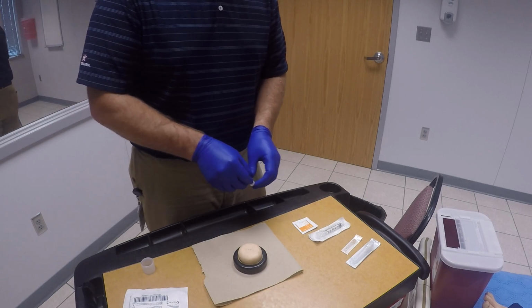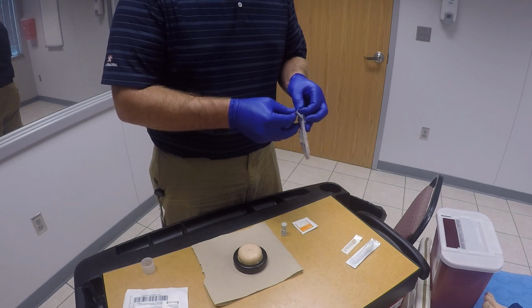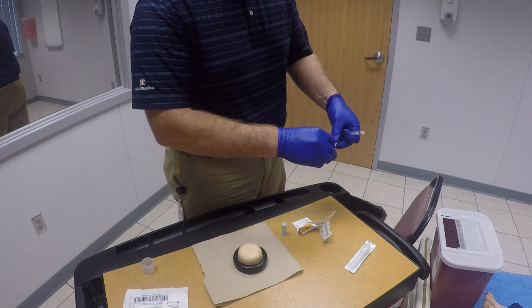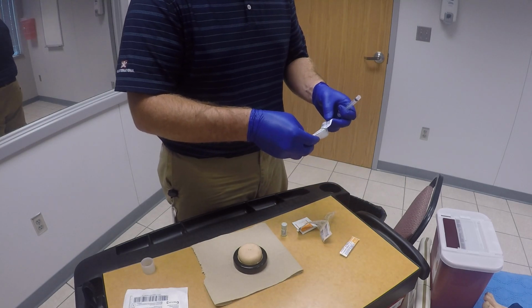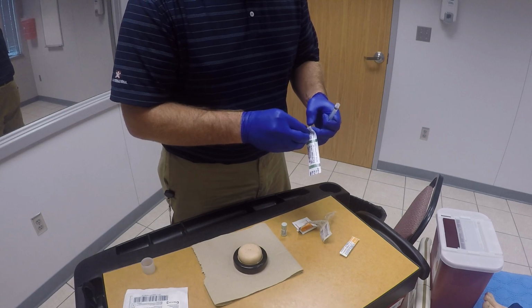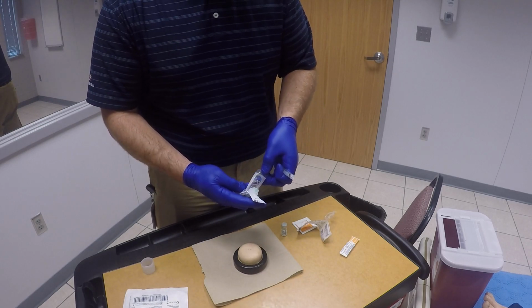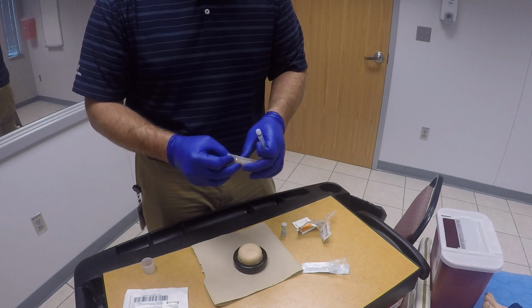We'll go ahead and get our syringe and needle ready. We're going to use a 3 ml syringe with this. Some of them come pre-attached to needles, some of them don't, so we'll want to determine that. And we're going to use this 21 gauge 1.5 inch long needle today. We're going to use that to actually give it, and then we're going to use this 25 gauge 1 inch needle to draw up our medication.